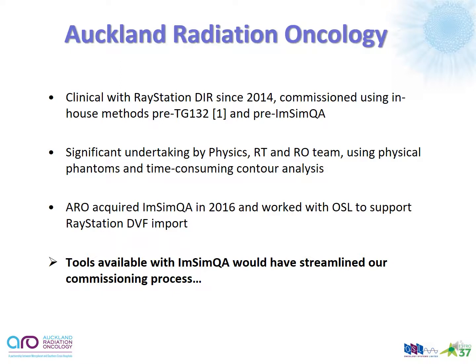We went clinical with RayStation DIR in 2014, and we commissioned this system using a variety of in-house methods. And all of this was pre-TG132 recommendations and pre-ImSimQA. Now obviously, I'm sure you can imagine this was a significant undertaking by the physics, radiation therapist and radiation oncologist team, and we used a variety of methods which included physical phantoms and time-consuming contour analysis.